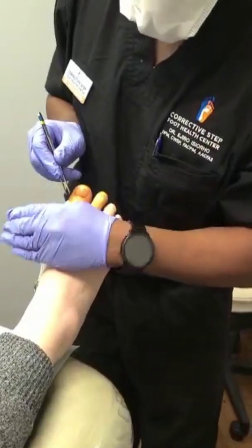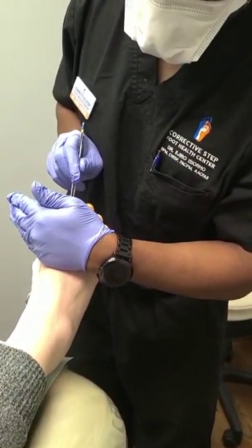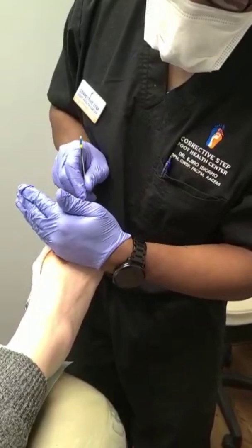Patient, can you feel anything? No. Okay, what about now? No. All right, what about now?